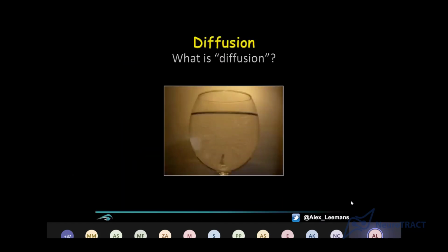All right. So obviously, when you want to know what diffusion MRI is, then you need to know what diffusion is. And diffusion, I think the simplest explanation is like with this glass of water and a drop of wine. If I put a drop of wine, or a drop of ink, depends on your preference, into the glass and you wait long enough, you'll get the same kind of hue in your glass, right? So all these molecules, they spread around.